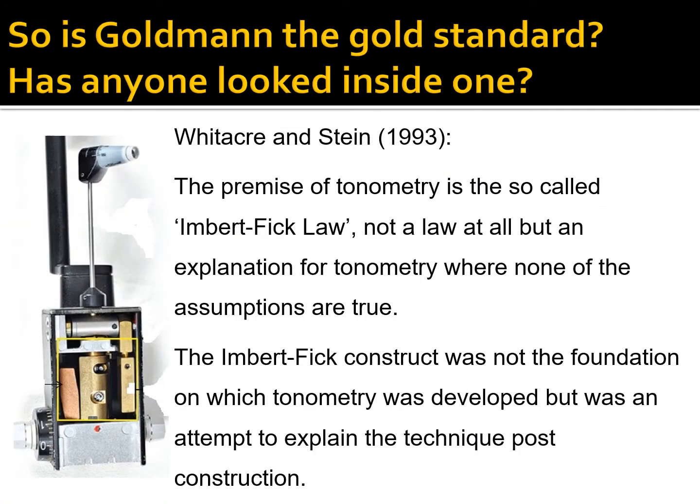So is the Goldman the gold standard? First of all, I ask you, has anyone actually ever looked inside one? This is the 21st century, and if you look inside one of those things, it's pretty primitive. And despite expert opinions saying it's still the best, and meta-analysis coming up with that because there's no contra evidence, there are some very, very famous people out there who do not think it's the best thing.